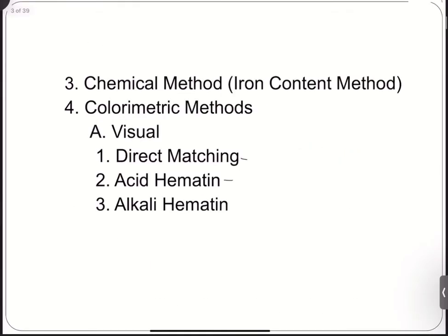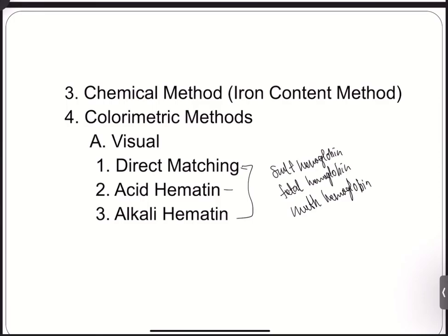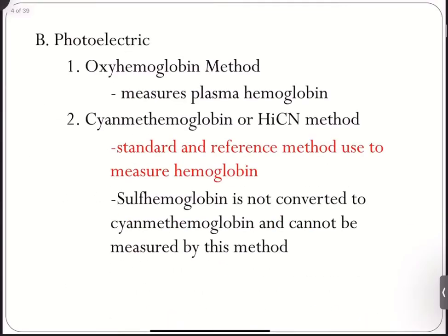On this acid hematin and alkali direct matching, it cannot read sulfhemoglobin, fetal hemoglobin, methemoglobin, and even sickle cells. Okay, they cannot identify or correlate those.